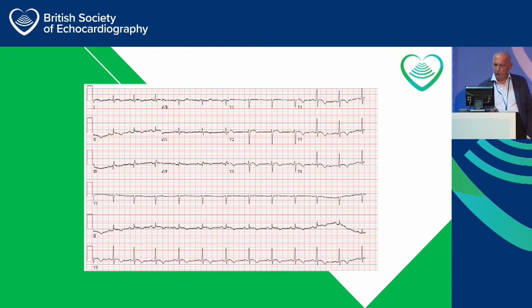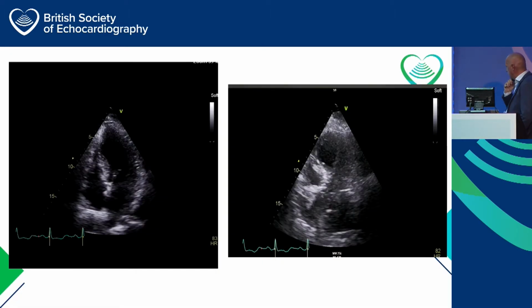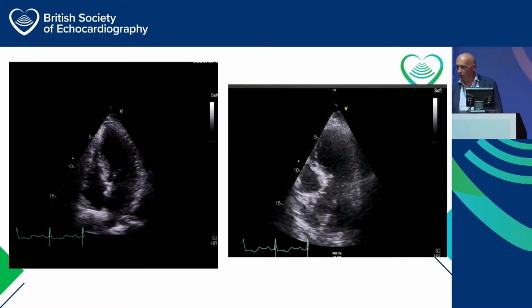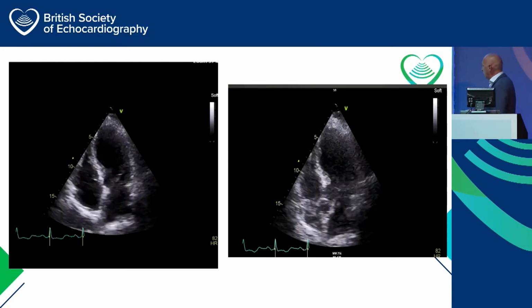So the important thing is, do we think those changes are related in normal coronaries? Are they seen in the normal coronary artery system? So this is her echocardiogram. And you have to forgive me because this is one of Martin's, that's why it looks shocking. But never mind. So let's just have a look.